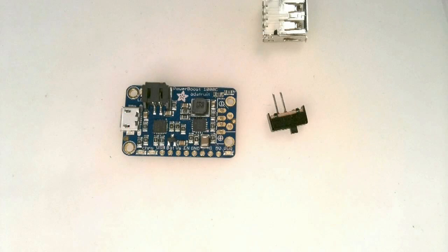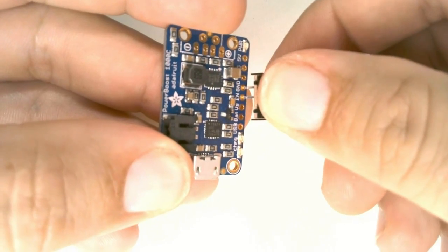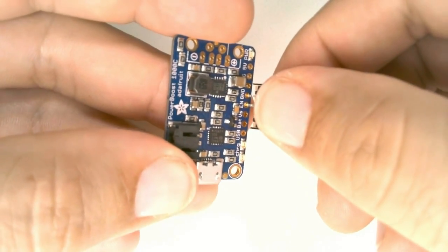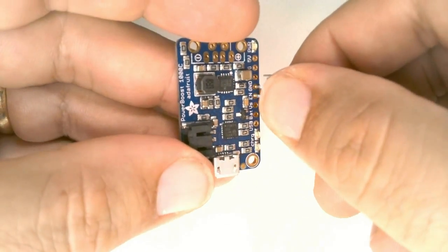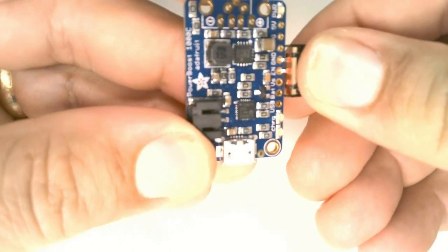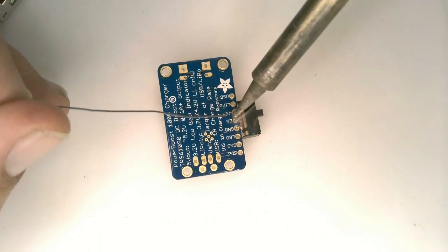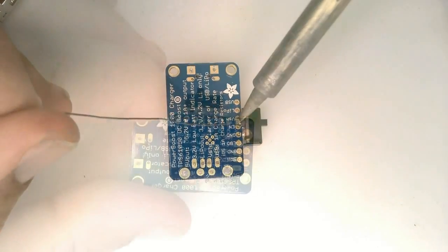Next, we will prepare the power boost board by installing a slide switch and a USB-A connector. We've already clipped off one of the 3 leads of the slide switch. Insert the outer pin into the ground hole and the center pin into the enable hole. Bend the leads over 90 degrees so that the switch is flush with the edge of the board. The board should look like this. Solder the leads on the underneath side of the board and clip off the excess.